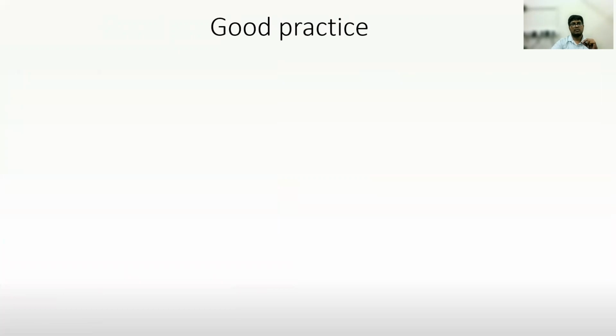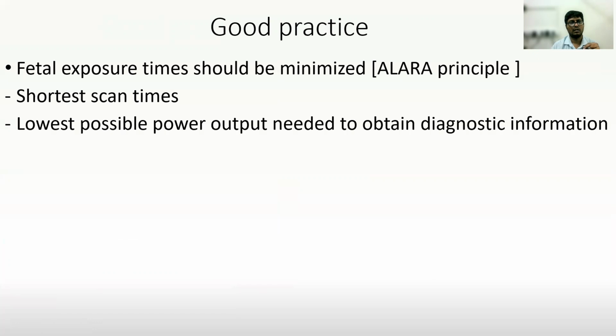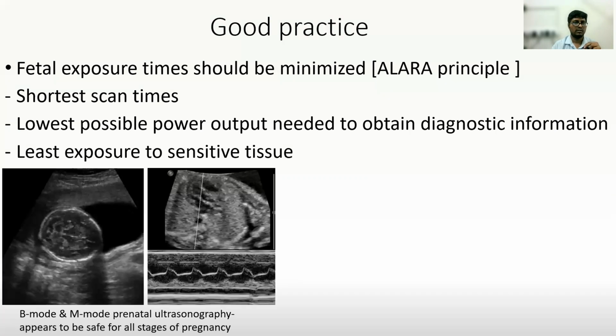Another good practice is that fetal exposure times should be minimized according to the ALARA principle, as low as reasonably achievable. The other thing is to have the shortest scan times possible, the lowest possible power output needed to obtain diagnostic information, and the least exposure to sensitive tissues like the heart. So these are good practice guidelines on the ultrasound machine.